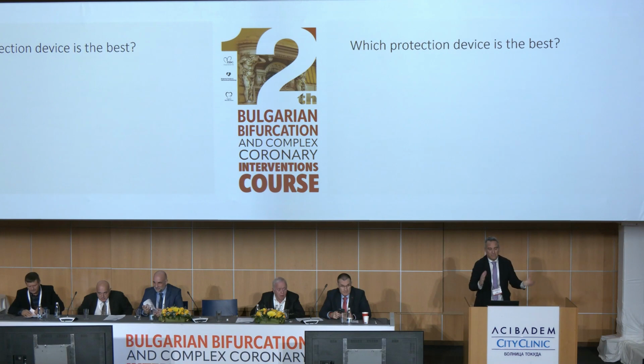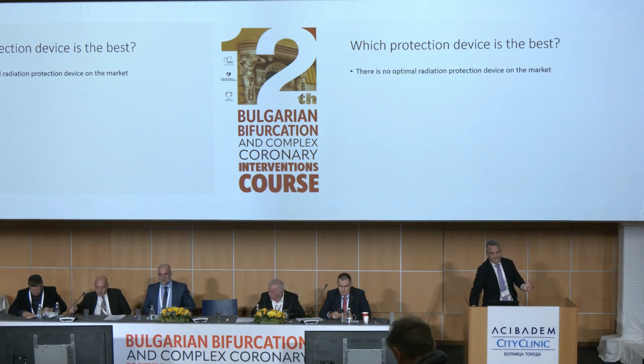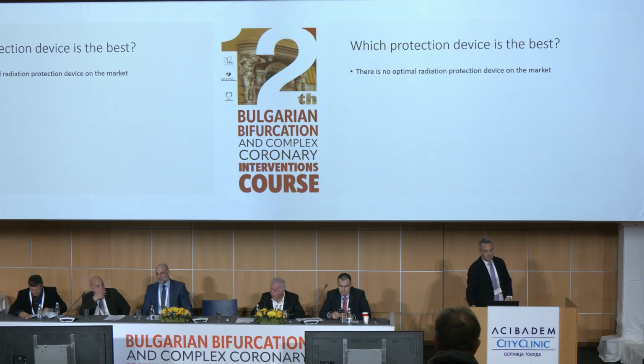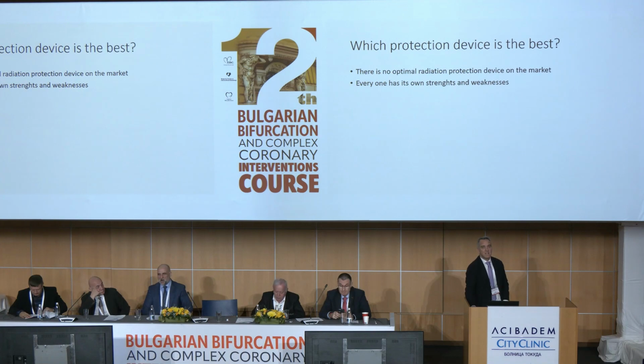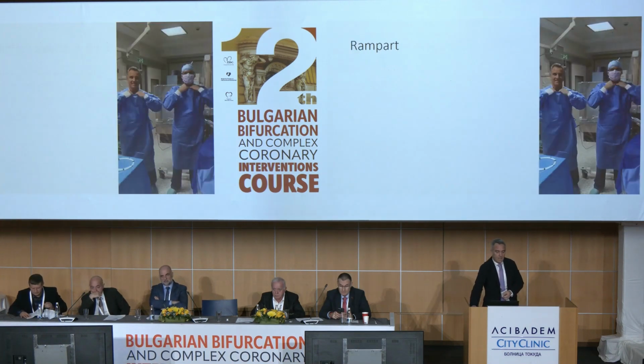So, which of these protection devices is the best? Well, I can't say. There is no optimal radiation protection device on the market currently. Everyone has its own strengths and weaknesses. If you choose one, you did a great job. You did a great job for yourself and for your colleagues.